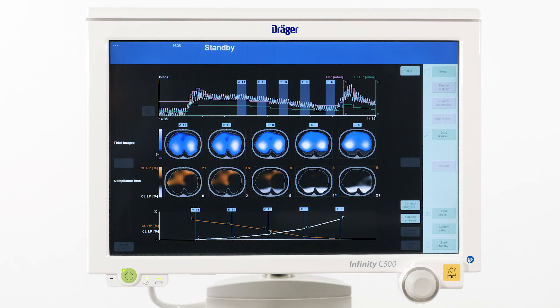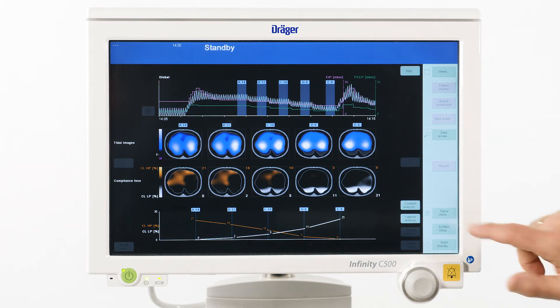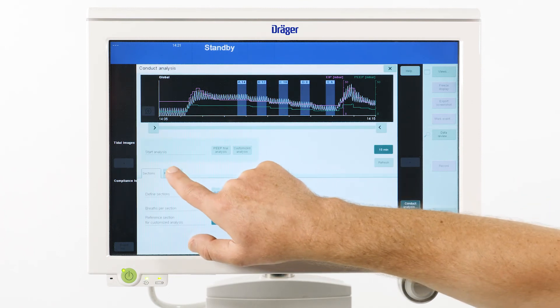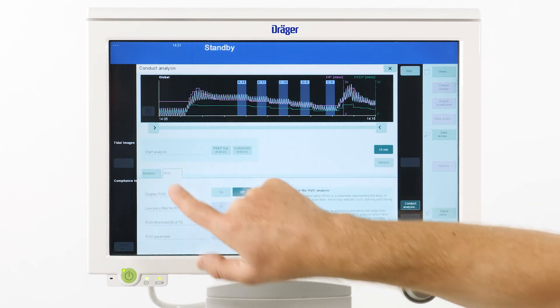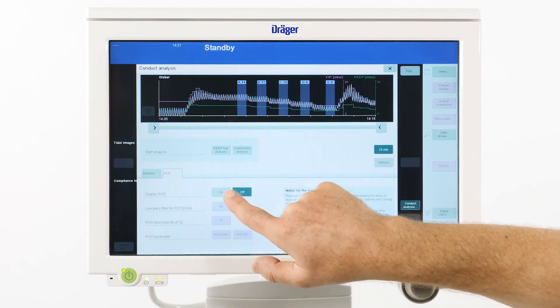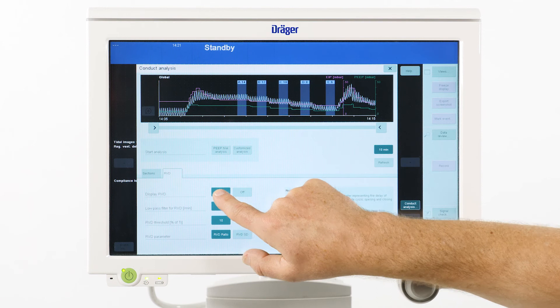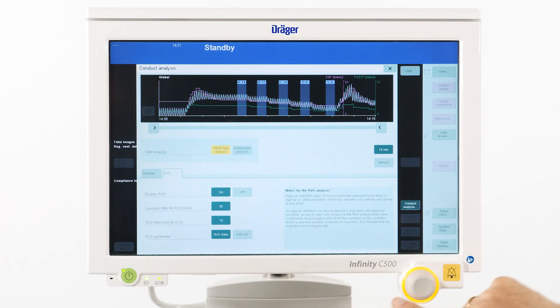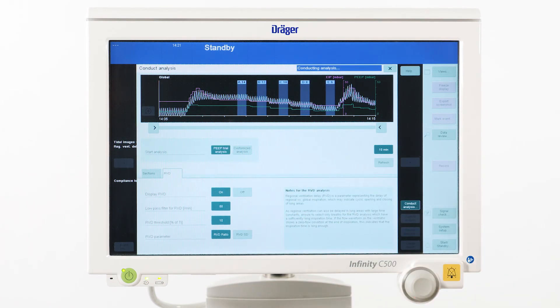If we are also interested to assess the homogeneity of the inspiratory dynamics, we can also display the regional ventilation delay. This parameter provides information about the time lag in each pixel in comparison with the global inspiration.